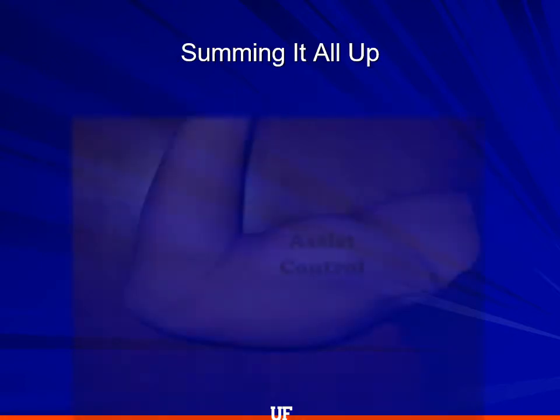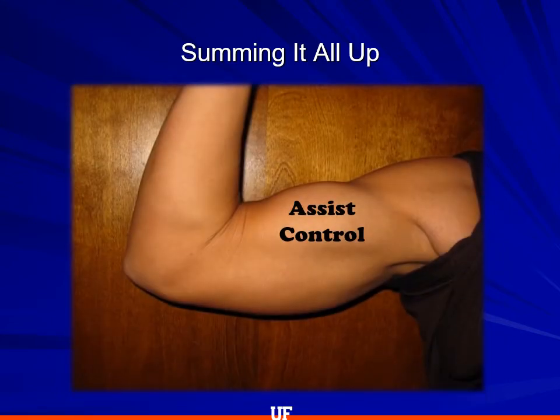So to sum it all up, turn on the vent, set it to assist control, figure out if your patient is obstruction or lung injury prevention group, set a good tidal volume, 6 to 8 per kilo of ideal body weight, titrate up and down on your respiratory rate, your FiO2, and your PEEP as needed, go slow on your respiratory rate in COPD and asthma. When somebody crashes suddenly, disconnect them from the vent and allow them to exhale because they were probably breath stacking, and then when in doubt, run through your DOPES mnemonic.